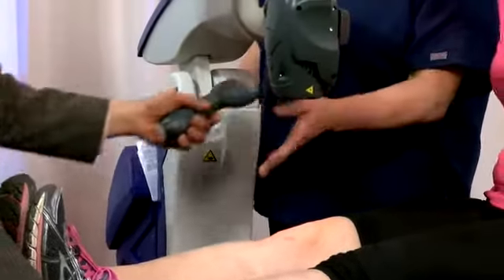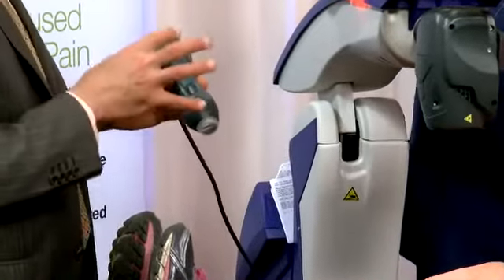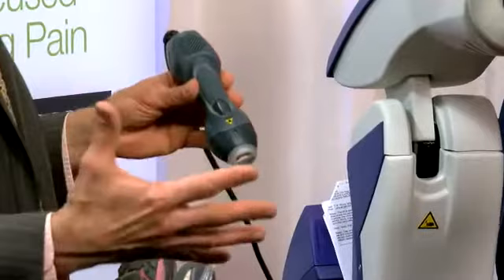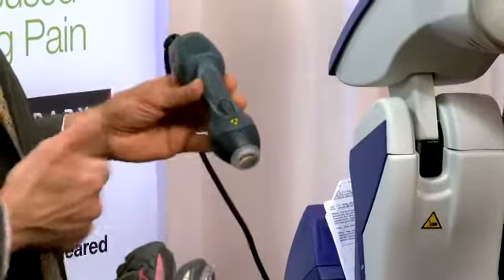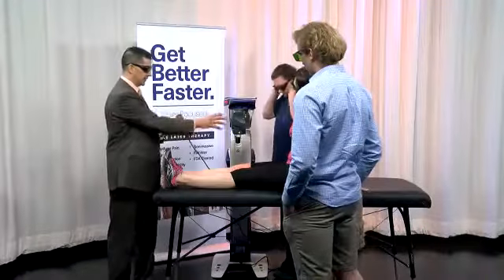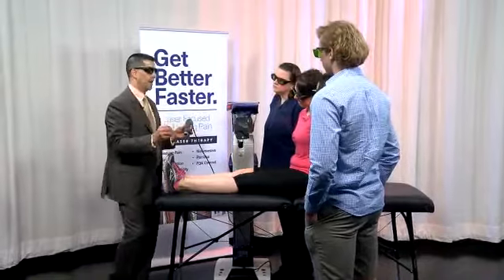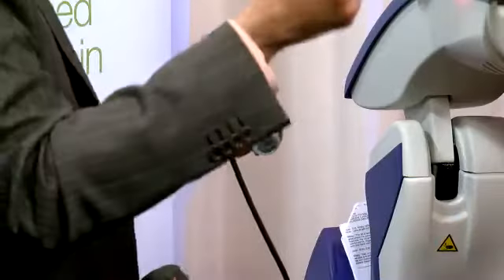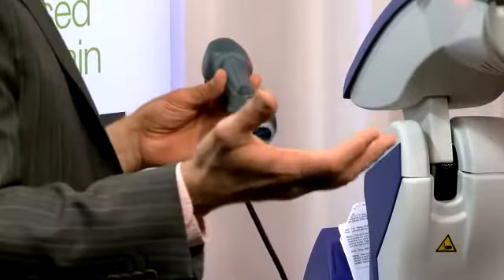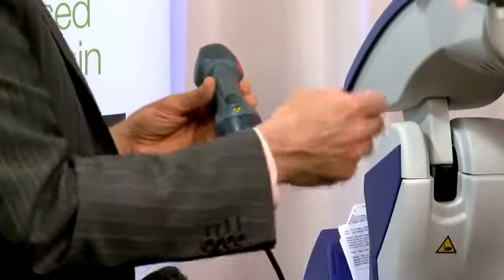This is the only robotic laser system I know of. A lot of laser systems that veterinarians, podiatrists, or chiropractors have use a hand piece like this — and we have both. The robotic part delivers a certain dosage of light energy, just like a dosage of a pill that you take. It calculates how much energy is going into the area and your cells absorb it.